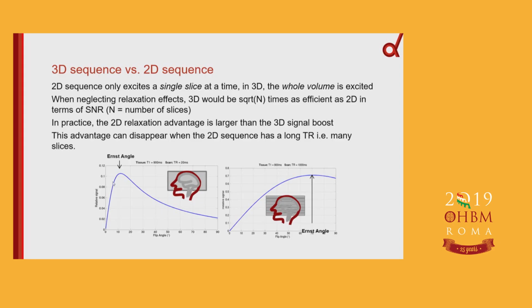And if we're looking at the sort of flip angles you get in terms of your SAR requirements, of course, if you're imaging with a short TR all the time, you're going to end up with a low Ernst angle compared to when you're doing 2D, and you'll get much higher flip angles as being the Ernst angle there.